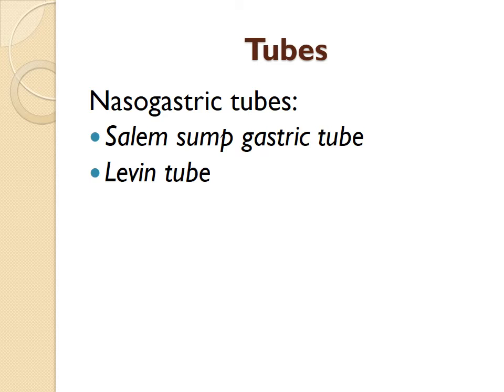The blue air tip then is never ever to be irrigated with any kind of liquid. Never. It should always stay above the abdominal area to prevent any kind of increased pressure within the abdominal cavity. If it is left lower than the stomach area, fluid may inadvertently back up into the blue port, and then it will no longer function as the air vent is meant to be.